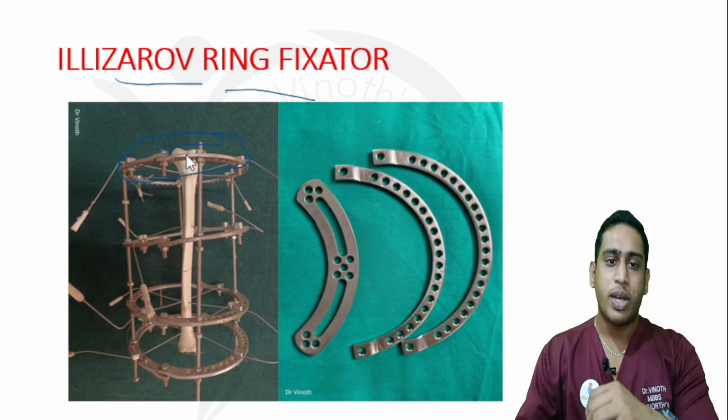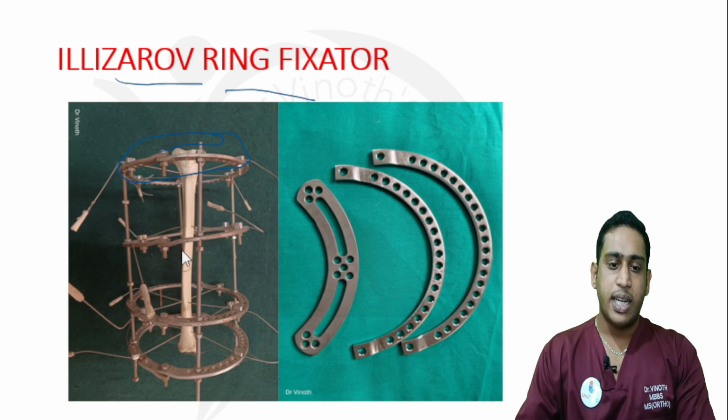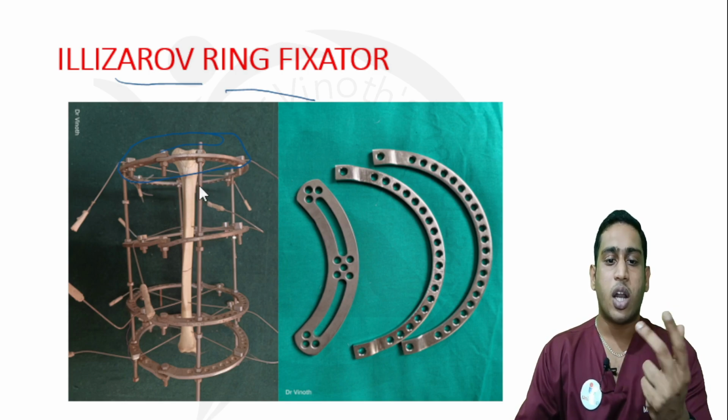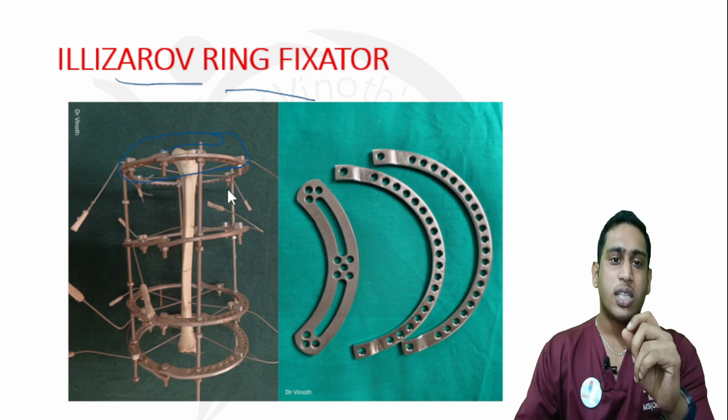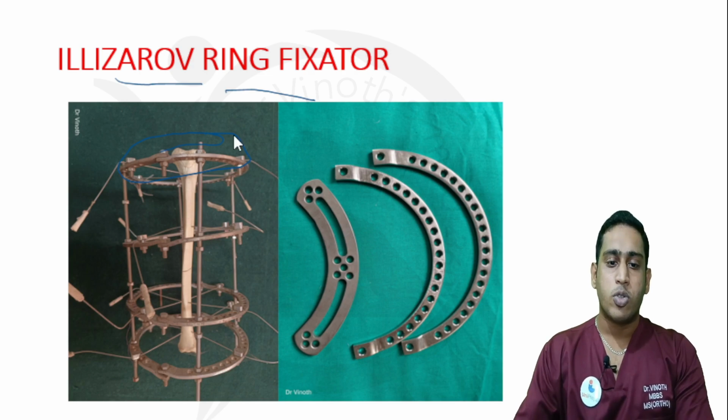Now I will be mentioning the components. Here in Ilizarov, we will be fixing the ring to the bone surface with the help of long K wires. There are two types of long K wires: the simple thin K wire, and one more called a K wire with the olive. The normal K wire will be like this, and the olive K wire will be having a bead.